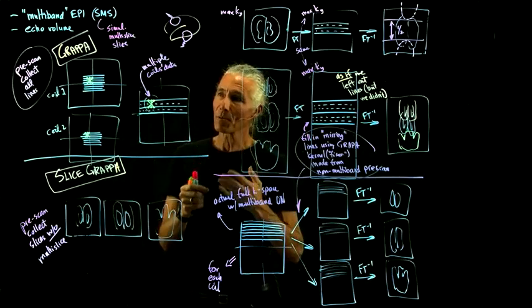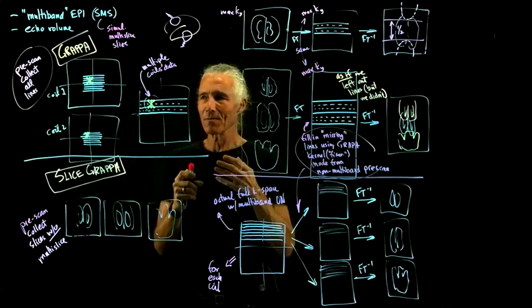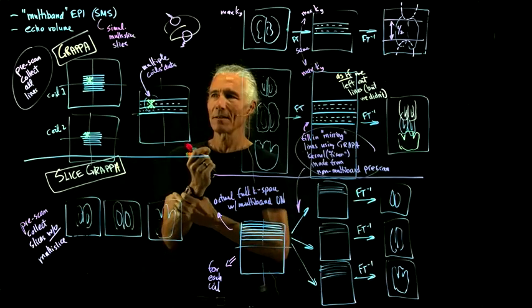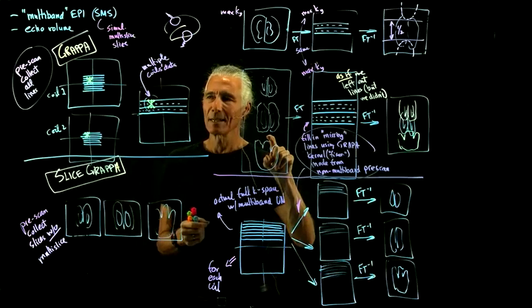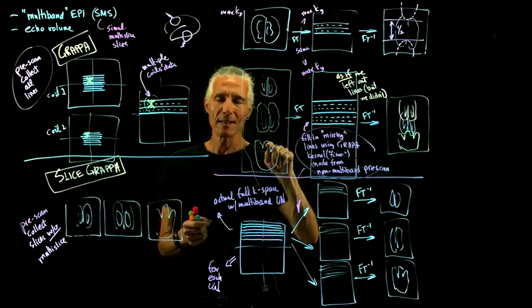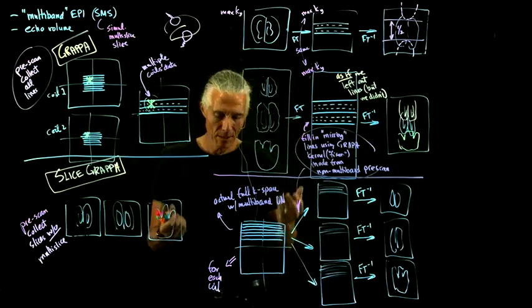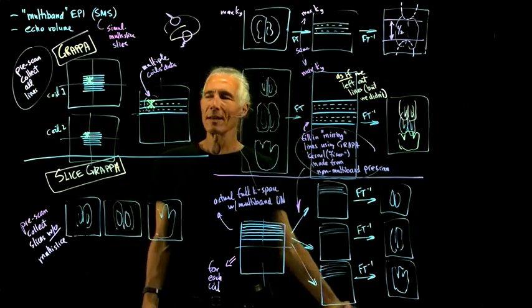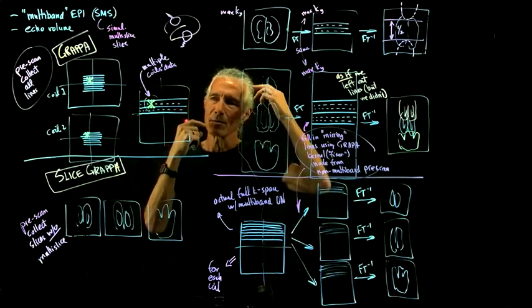And why is it worthwhile understanding how it works? Well, it's worthwhile to get a feel for what the possible artifacts are. If you haven't perfectly un-overlapped the slices, obviously you're going to cause data from one part of the brain to be pasted onto data from another part of the brain. This could be particularly damaging if you're using functional MRI data to look at functional correlations between different parts of the brain.